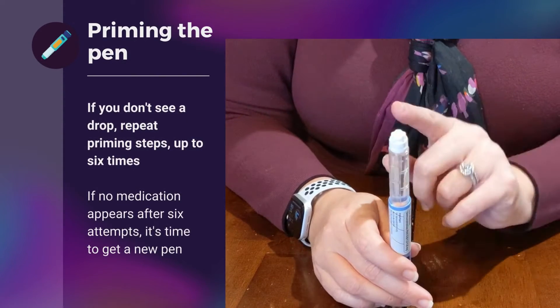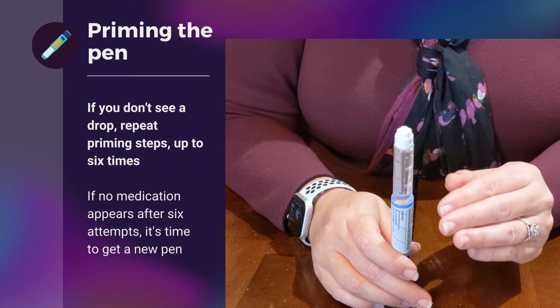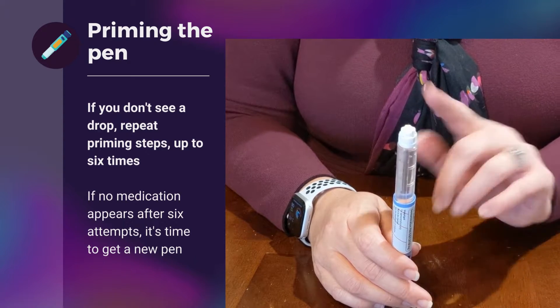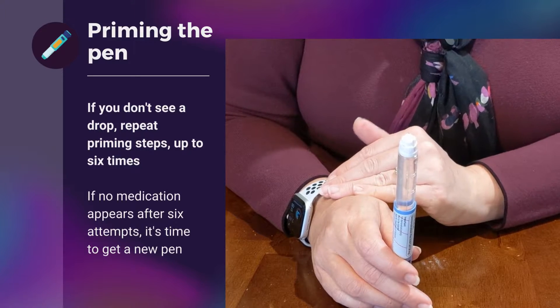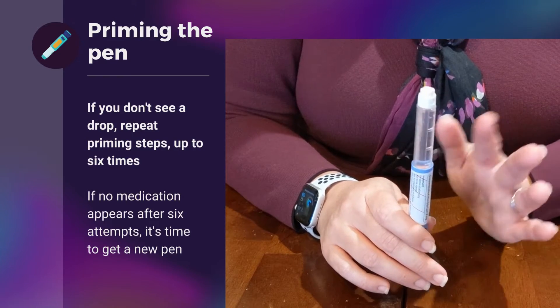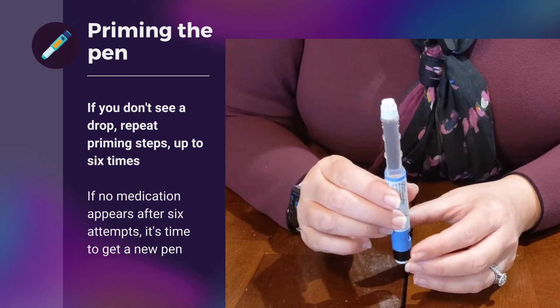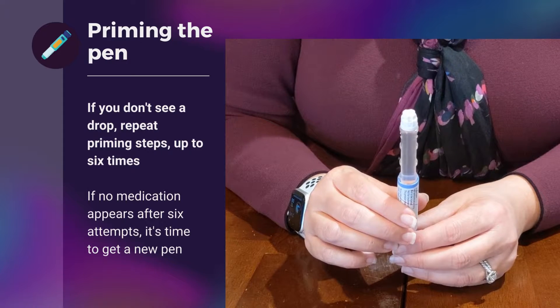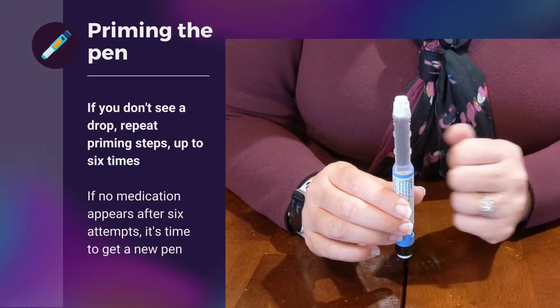Should you not see a drop the first time, you can try up to six times. You want to be sure that you get that drop before moving on to give yourself an injection. Should you not see any liquid come out the top of the needle, it's time to get a new pen, because something is wrong with the brand new pen. That is a very rare thing, but I just wanted to point it out.